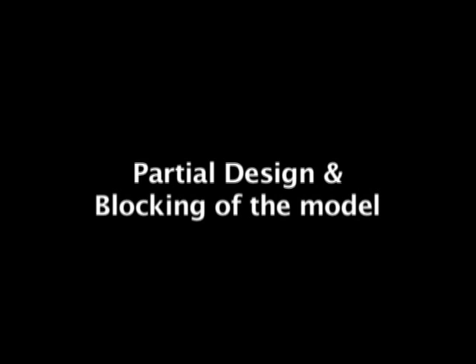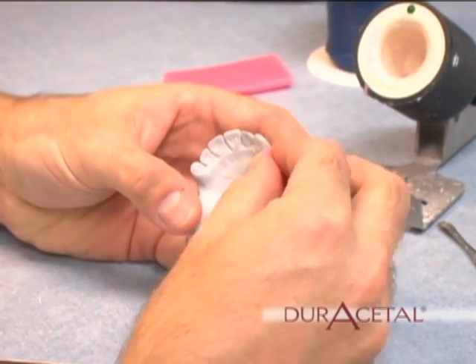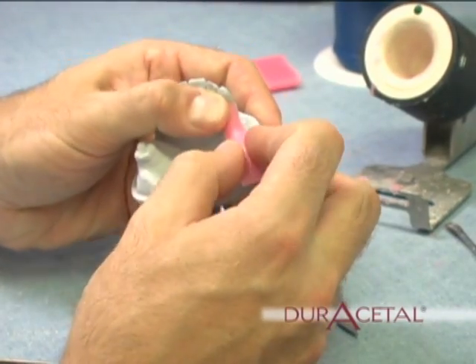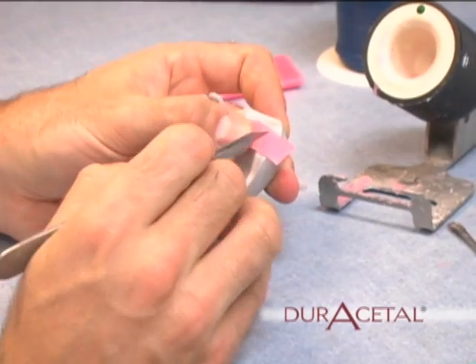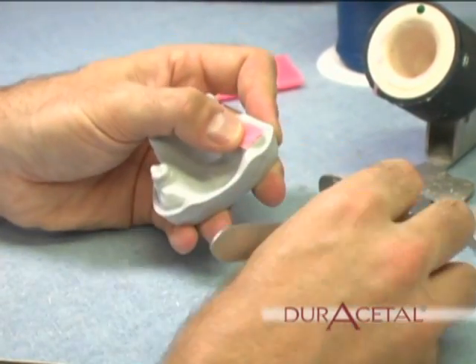Partial design and blocking out the model. Using wax, block out the saddles of the model. The wax needs to be one to one-and-a-half millimeters thick, which is about the thickness of the base plate wax. This is going to create relief for the application of the acrylic later.